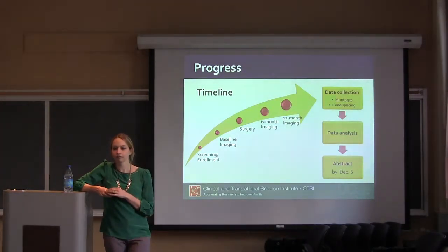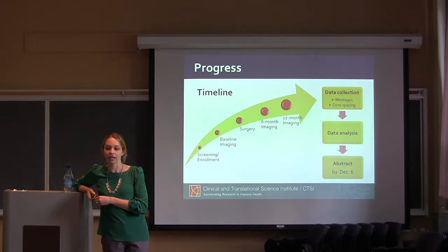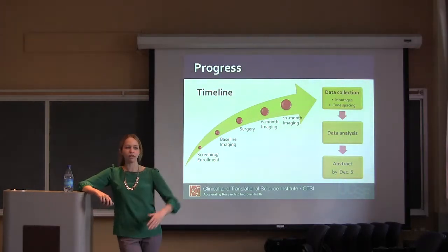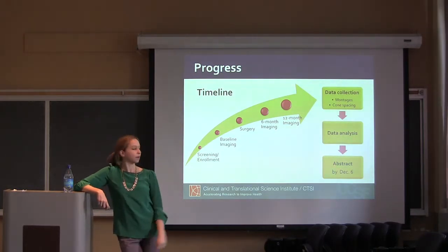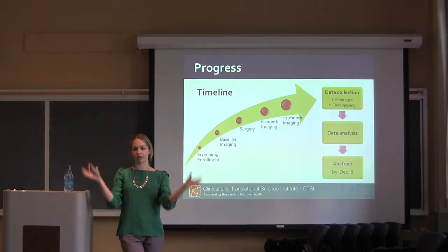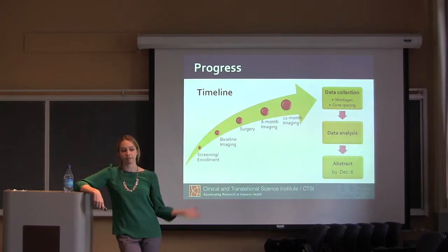The specific regions that are analyzed by the various graders, are they done essentially at the same time as the other graders? Like a specific region, will that be the fourth image that every single grader does? Yeah, they are. The computer just goes through the list of regions, identifies the exact coordinate on that image of the retina, and that's where you count the cones. So there is consistency from grader to grader in terms of how they do it, and when they do it.